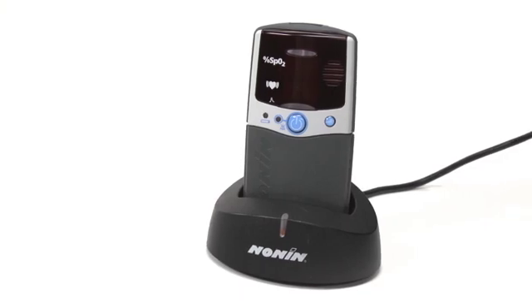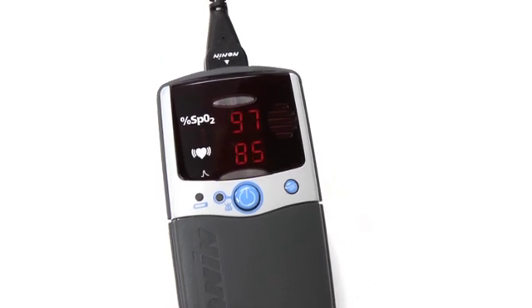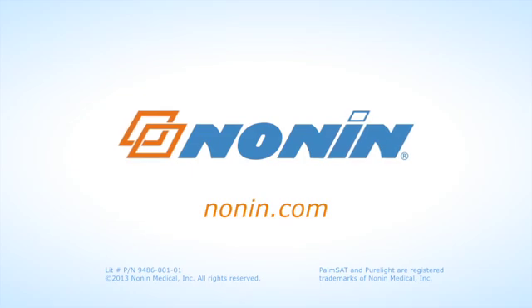With proper use, the Nonin PalmSat Model 2500 or 2500A Pulse Oximeter will provide consistent, accurate oxygen saturation and pulse rate measurement. You can find additional use information on this and other Nonin products at www.nonin.com.